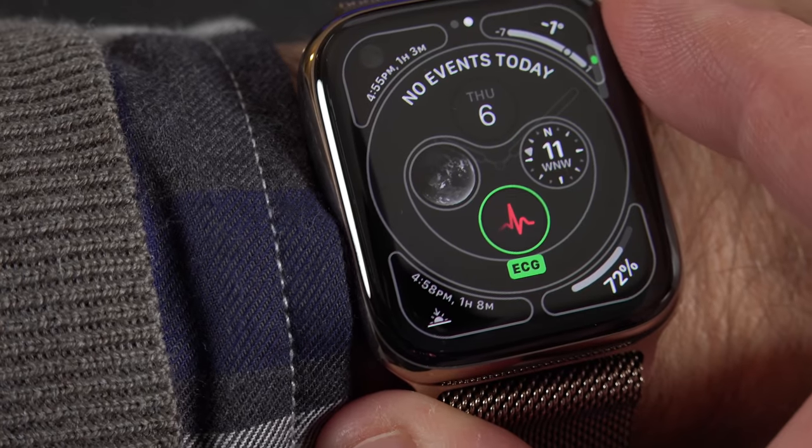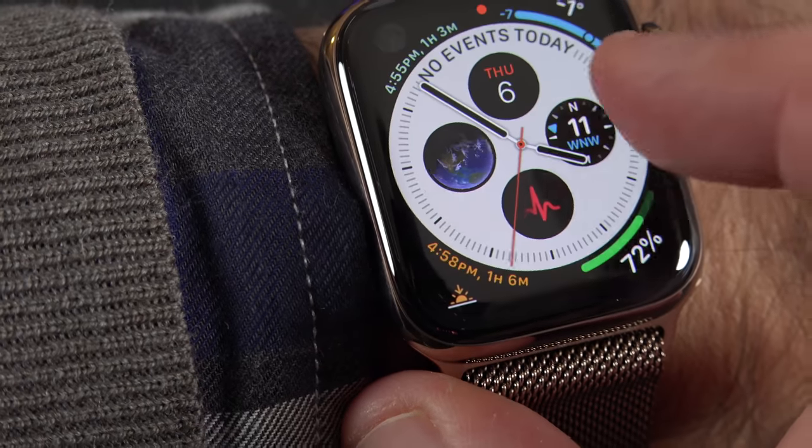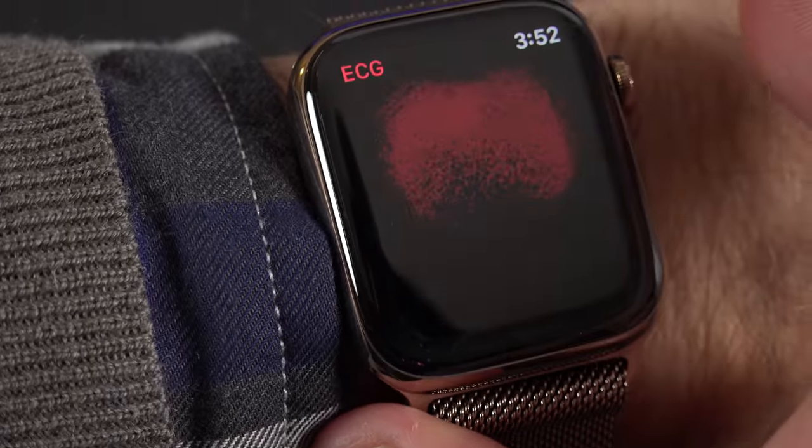If you plan to use the EKG often, what you might want to do is add the complication to your watch face. That's a nice quick shortcut for getting right to the app.